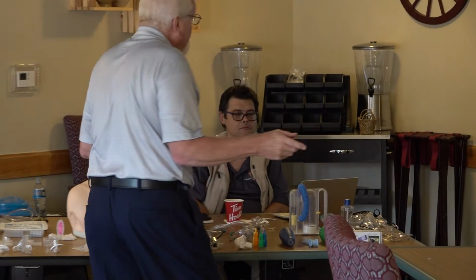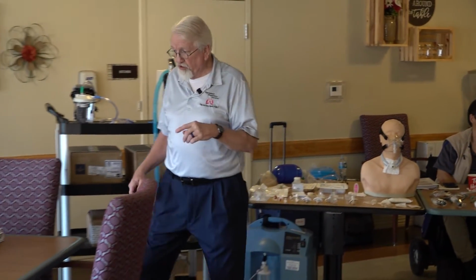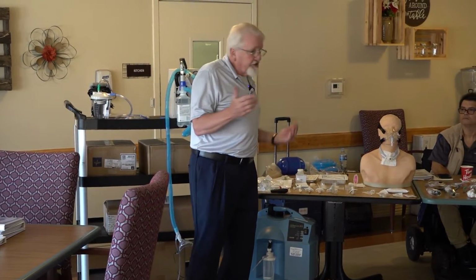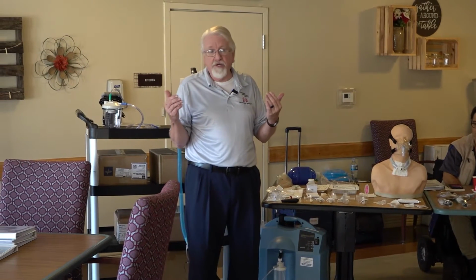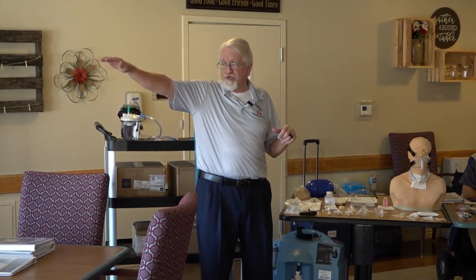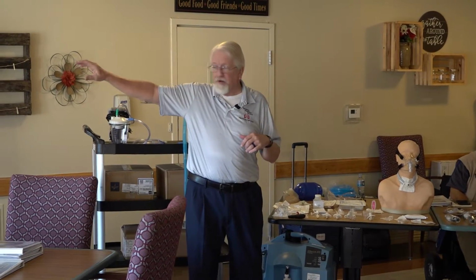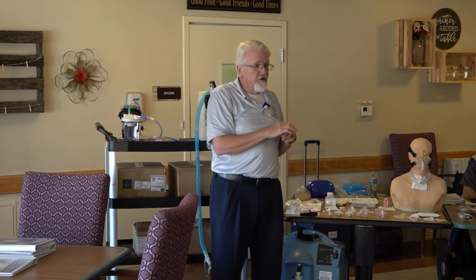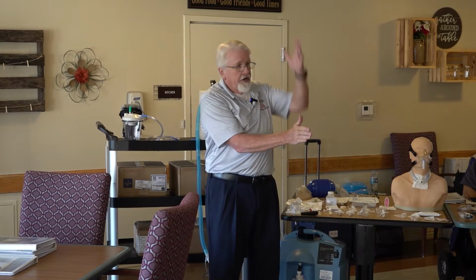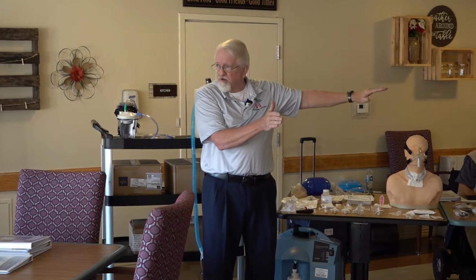You can follow through in your notebook. You'll see the breakdowns of the O2 with the flows and everything. So this is the example I give to demonstrate entrainment. Okay, so I have a stream of 100% oxygen flying by me right here in front. Okay, and that's 100%. And then all of a sudden, I build a wall, and I put a wall here, and I put a wall here. So my stream is still flying right through that opening.